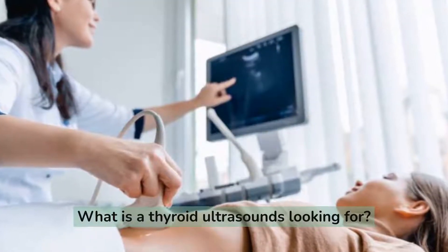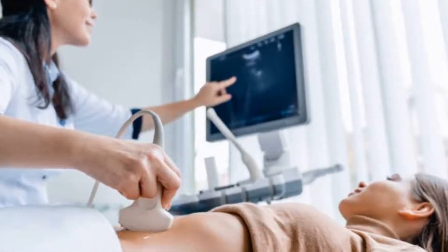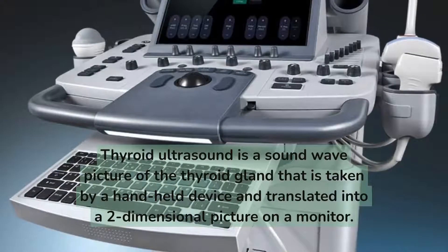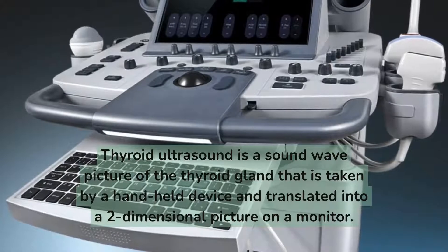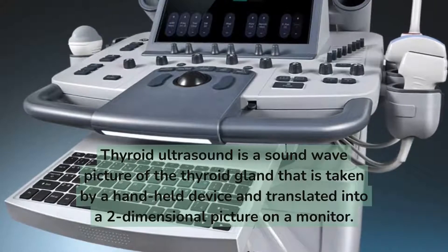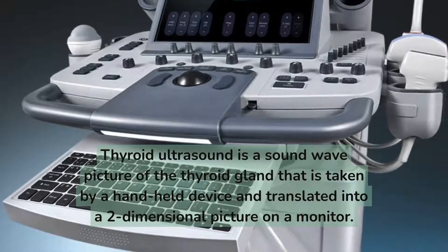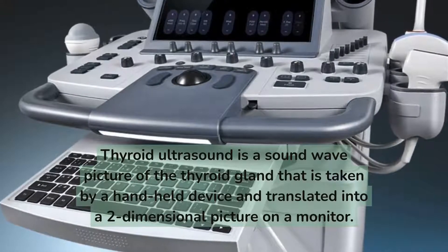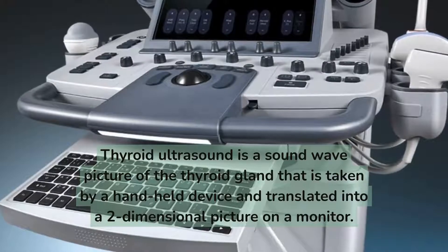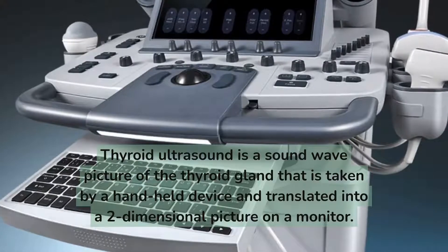What is a thyroid ultrasound looking for? Thyroid ultrasound is a sound wave picture of the thyroid gland that is taken by a handheld device and translated into a two-dimensional picture on a monitor.